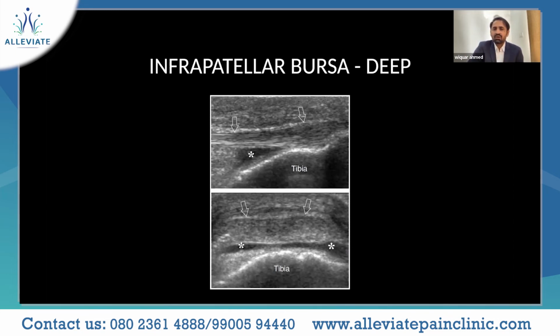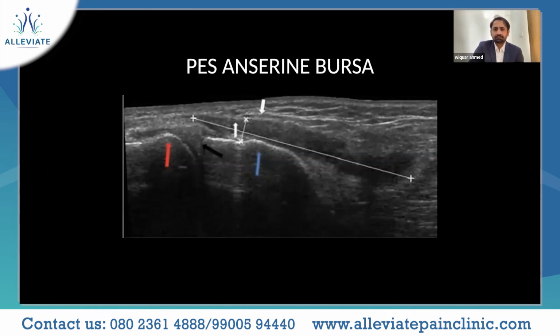But for pathology of the ACL, it's always better that MRI is very specific. It's a deeper ligament. PCL intervention and diagnosis can be done a little bit in the posterior aspect. Ligaments are more compact as compared to your tendons. This is also an important thing which you need to remember, the difference between a tendon and a ligament.